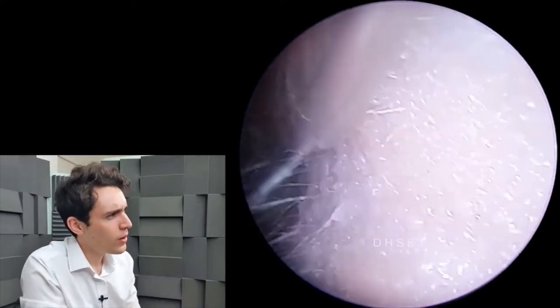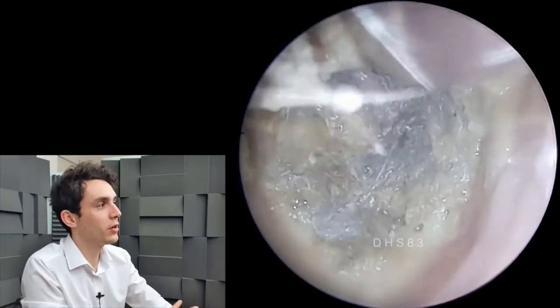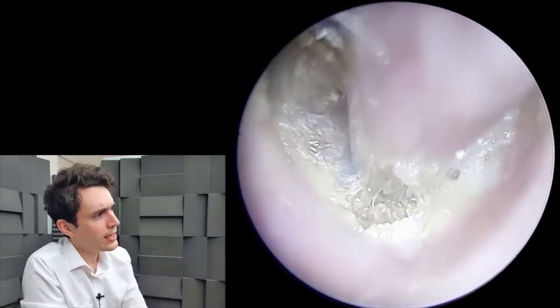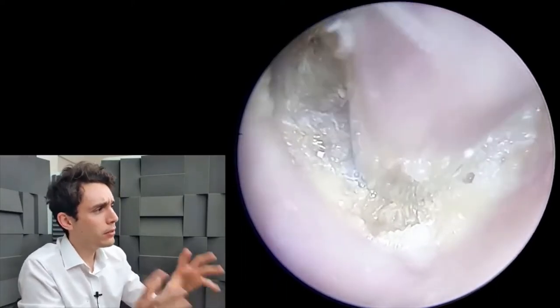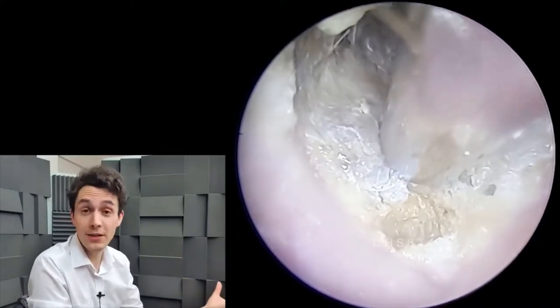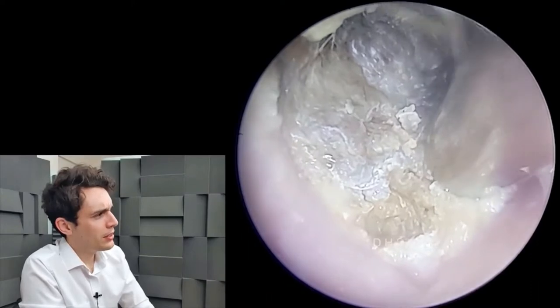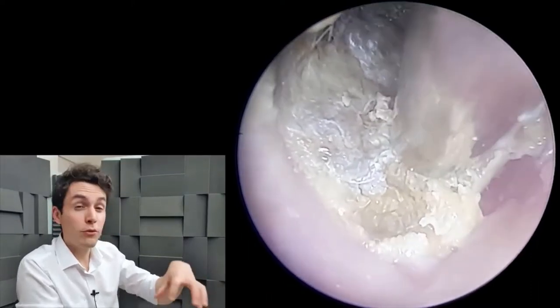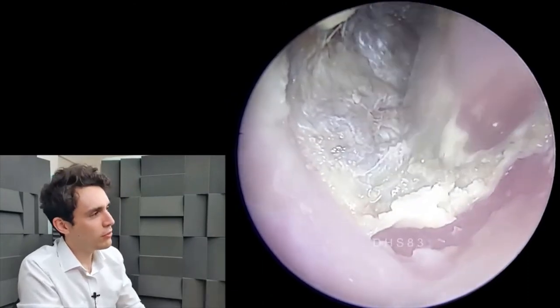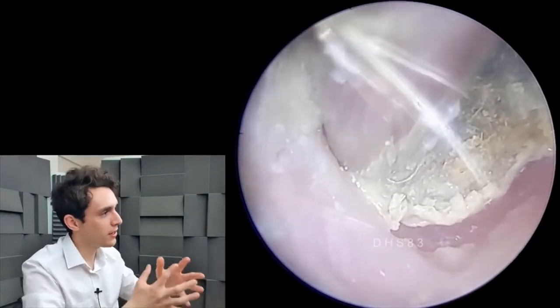I'm going to show you a new tool which I've been wanting to use for quite some time. First and foremost, what we have here is a very dense plug of dead skin occluding this ear, and there's also the same case on the other side. I'll use this new tool on each ear, but as you can see I'm really struggling because it's so dry and crusty. I'm trying all the usual techniques here to lift up from the sides and roll it together like a parcel.